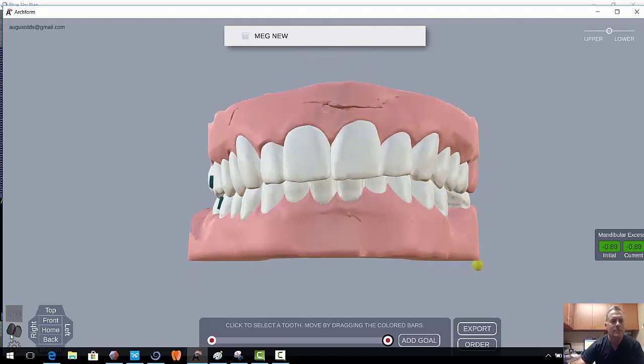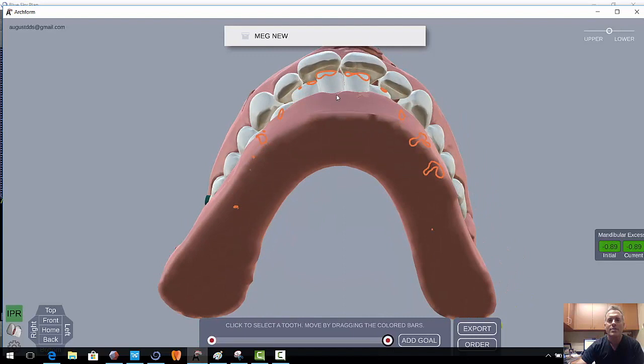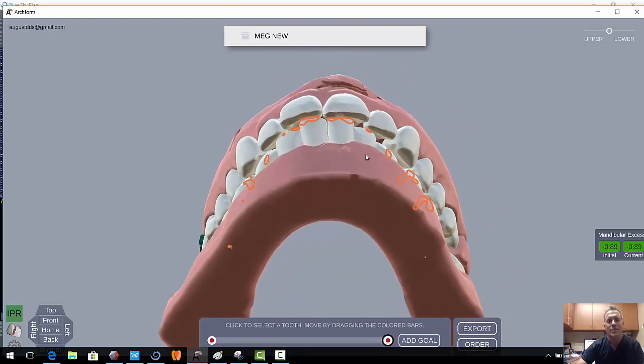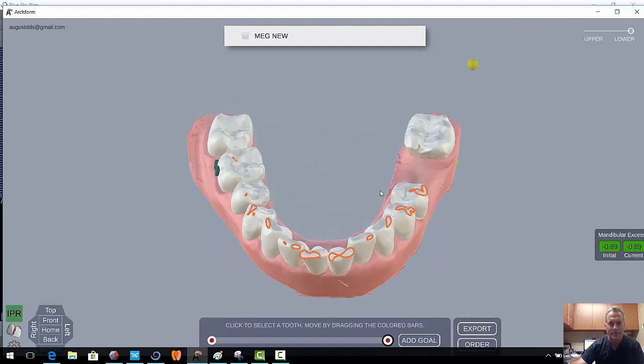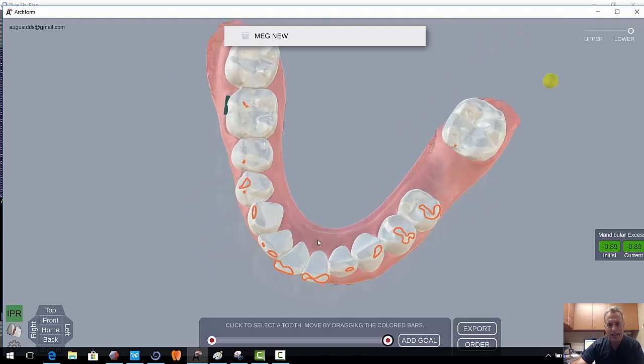We can turn on our IPR and our Show Collisions so that we can see when teeth move how much IPR we're going to do. So it looks like our nemesis is going to be those lower anterior teeth. So I'm going to go ahead and start with those first. So let's get rid of the upper. And you can see where the teeth are contacting.